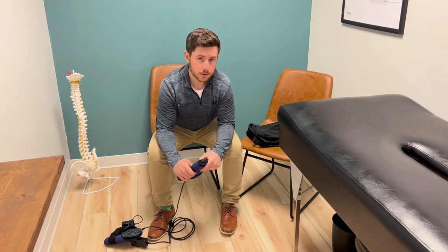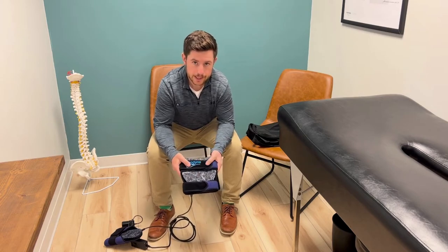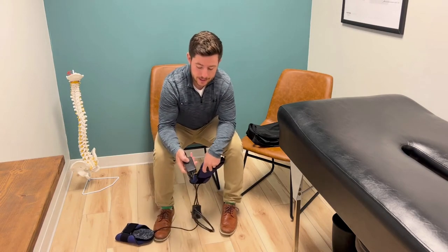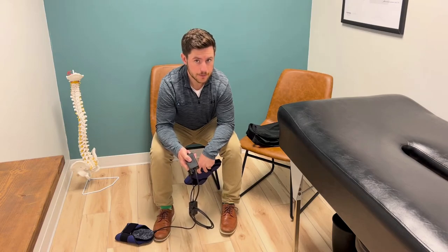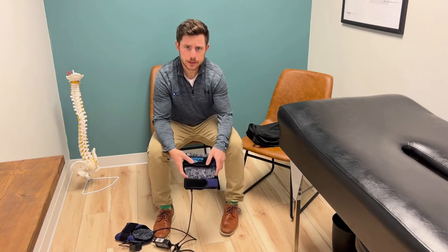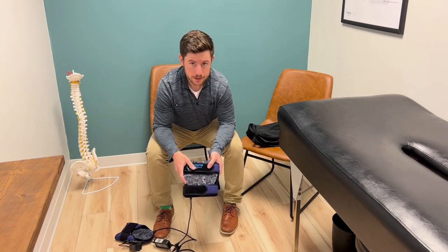There are a couple of key things when it comes to low-level light therapy. This infrared, 890 nanometers, is typically not visible to the naked eye. What I want you to base your treatment off of is the green light that we were talking about — if that's on, it's telling you that the treatment is working. You may also feel a little bit of warmth from these pads; it's completely normal. Some people feel it, some people don't, but it's telling you that the treatment is working.